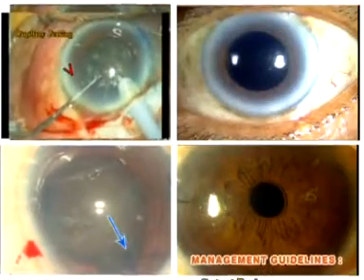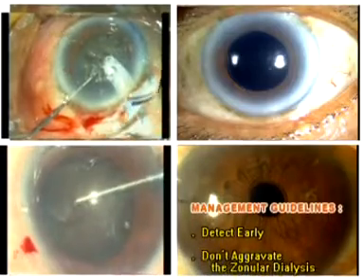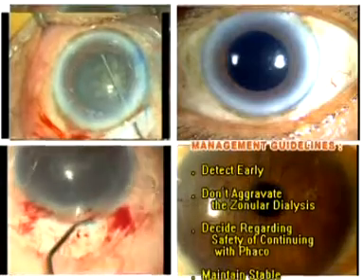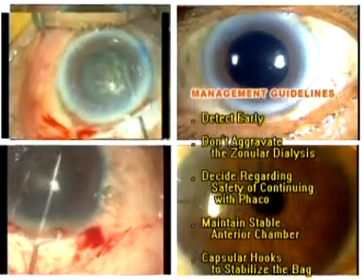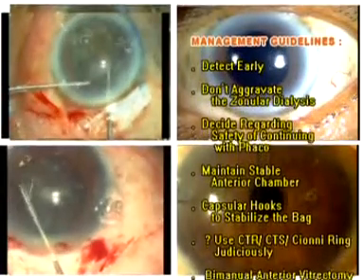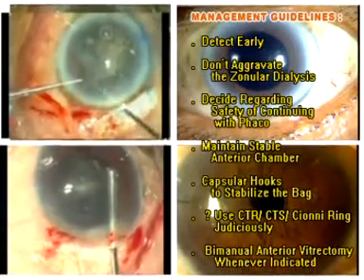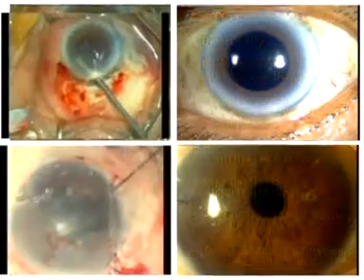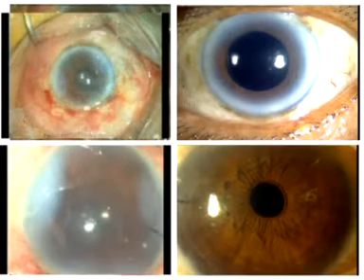The strategy for the management of such complications should include early detection, prevention of aggravation of the zonular dialysis, deciding whether it is safe to continue with further phacoemulsification, maintaining anterior chamber depth, stabilizing the capsular bag with capsular hooks, making a judicious decision regarding the use of capsule tension ring, capsule tension segment or Cionni modified capsule tension ring, and bimanual anterior vitrectomy whenever indicated. In conclusion, choice of an appropriate strategy tailored to individual patient requirements will optimize the results of modern cataract surgery in hard cataracts even in the presence of intraoperative zonular dialysis.